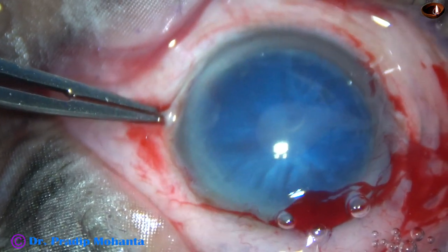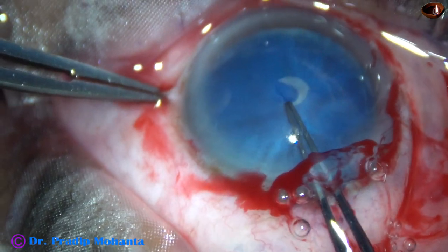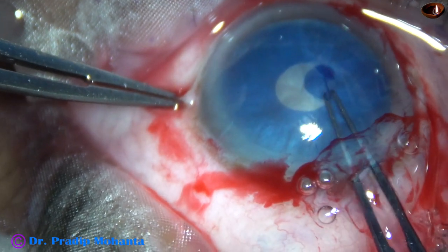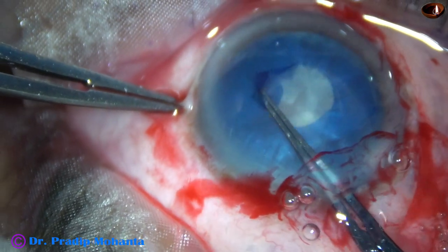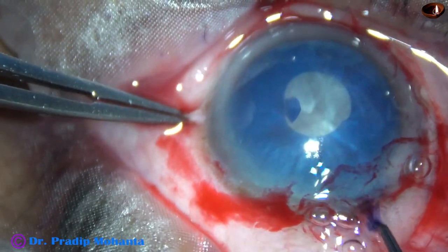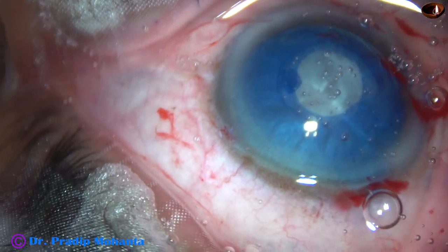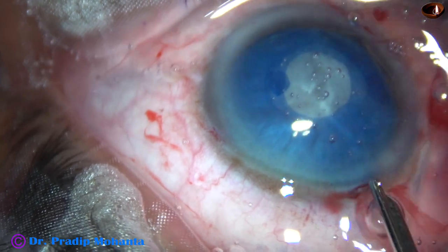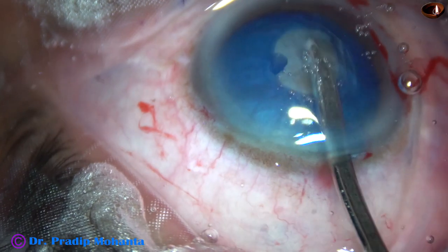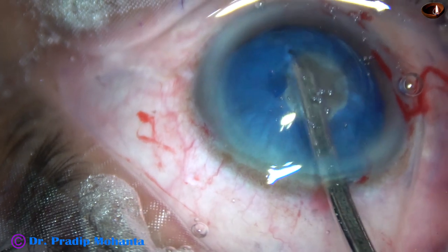And make a puncture onto the anterior capsule. Milky fluid comes out. So the intralenticular pressure is high. The anterior chamber is also shallow. So I make a small rhexis first. And now I am going to reduce the intralenticular pressure. Now, see the appearance of the nucleus as I remove the white covering — this is a huge and very hard nucleus.